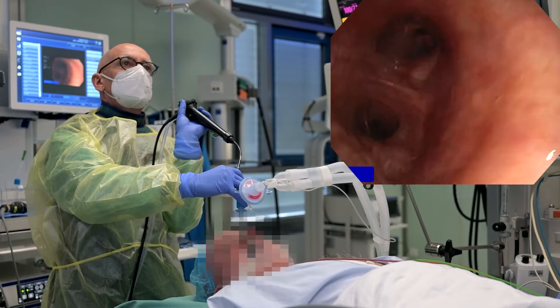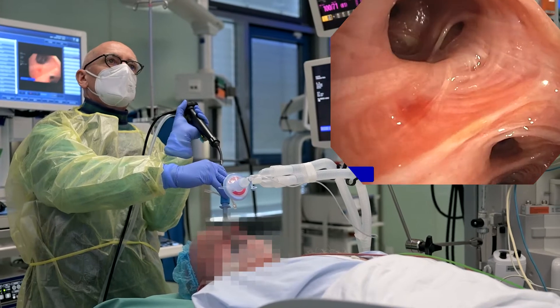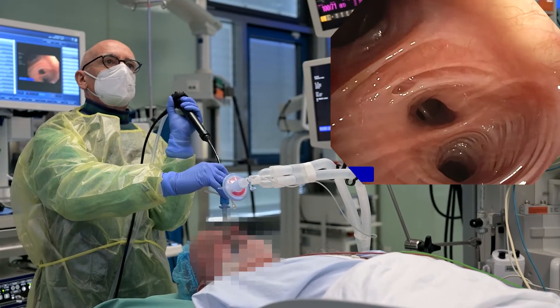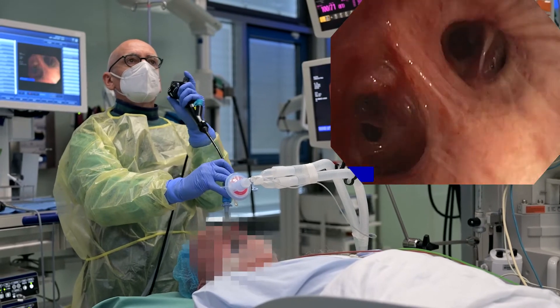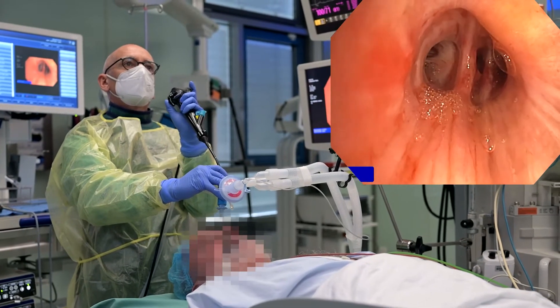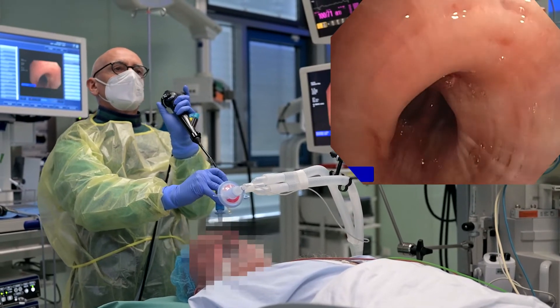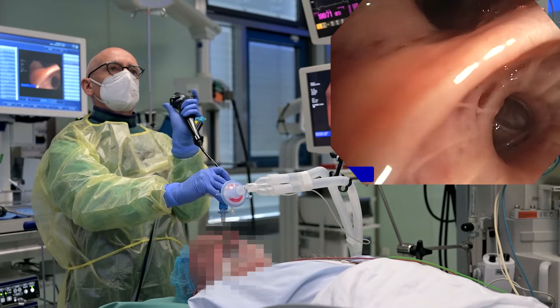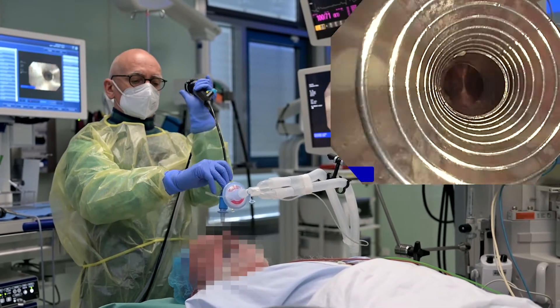Moderate bleedings are reported to occur in 6% of patients. In a large retrospective multicenter cohort, 3.5% of patients experienced clinically significant bleeding that required ice-cold saline or epinephrine injection. The dense morphology of the tumor decreases the likelihood of excessive bleedings. For safety reasons, an endobronchial blocker can be used.